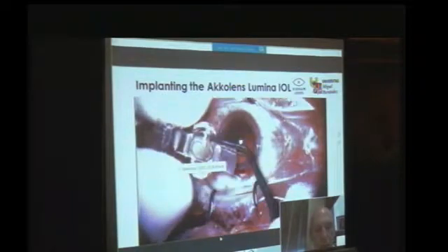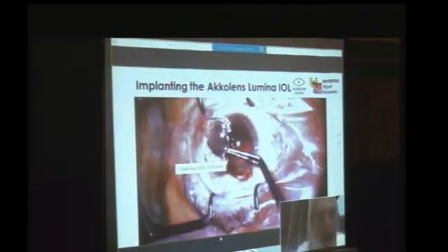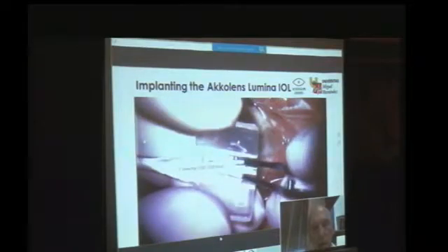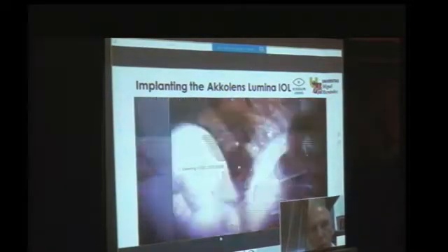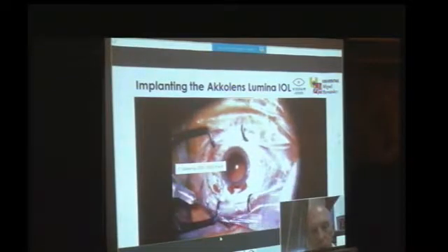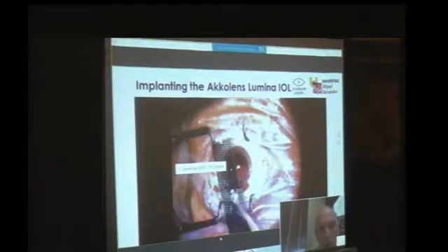The lens is implanted with an injector. The injector is just a standard one that we use, and is very similar to any one that you use in the market. The lens should be placed exactly in a position that is marked by the cartridge. Actually, you have marks in the lens to identify if the lens is upside down and to avoid this implantation, because upside down will decrease the performance and indeed the final refraction of the patient. And then we load the cartridge with viscoelastic, and we are ready to implant this lens in the sulcus.